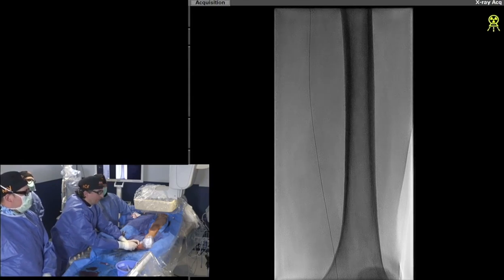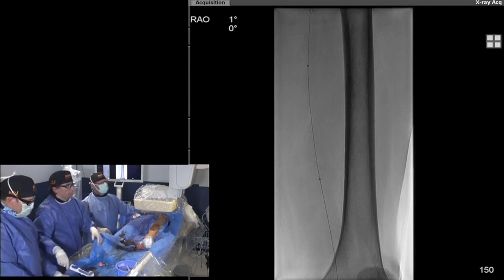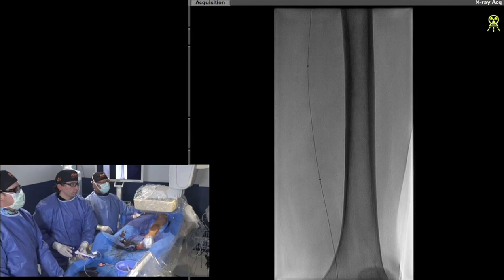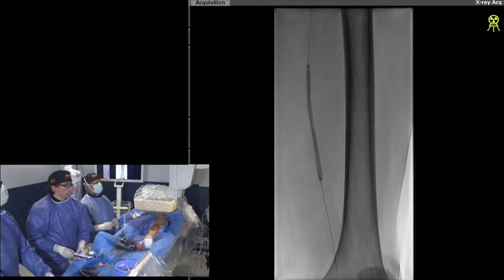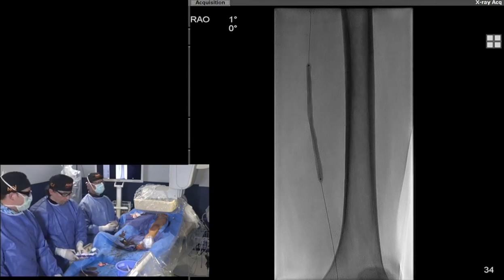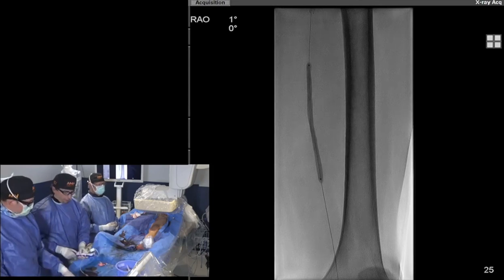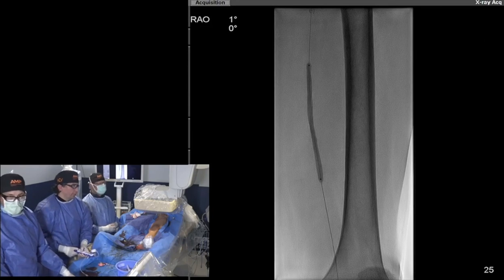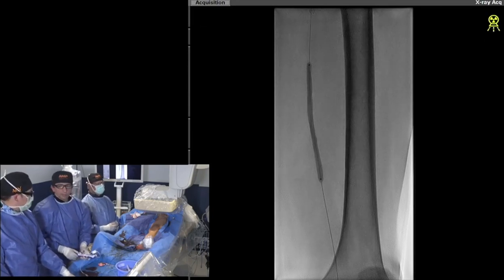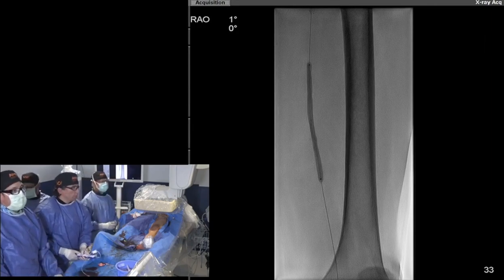Can I have a 6.0 x 200, five French? I'm just ballooning it again while they're getting the stent so it doesn't get stuck there. Fatty, who's doing the circulation for you and who's scrubbing for you?